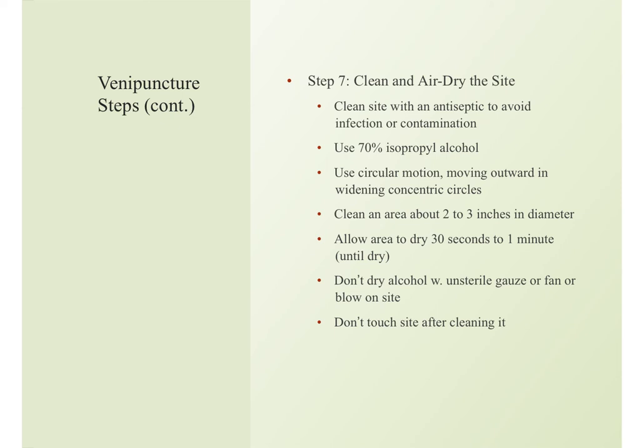We don't stick before it has dried because it is alcohol. It can lyse the cell. It can contaminate the specimen, and it stings. Okay? Let it air dry. It does not always take a whole 30 seconds. Don't dry the alcohol. It's not your job. Let it air dry. And don't touch the site after cleaning.